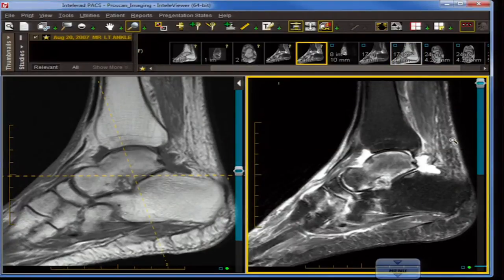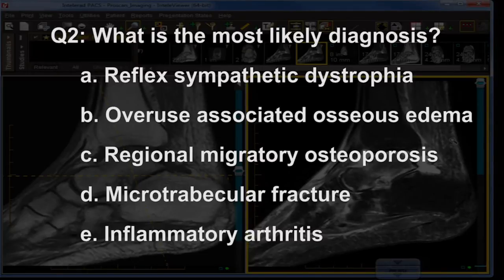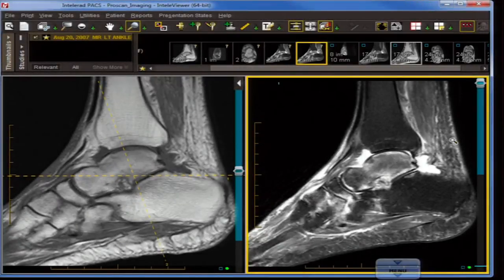Question number two: what is the most likely diagnosis given these imaging findings? A is reflex sympathetic dystrophy, B is overuse-associated osseous edema, C is regional migratory osteoporosis, D is microtrabecular fracture, and E is inflammatory arthritis.